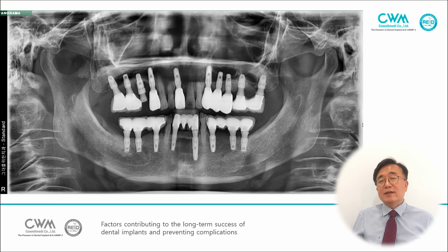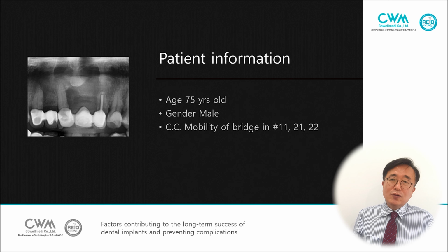If you keep the drill depth and the buccal bone width 2 mm, there will be no marginal bone loss and peri-implantitis.